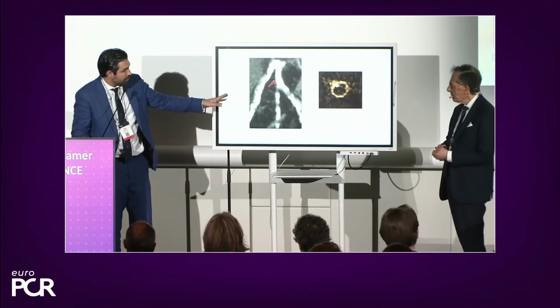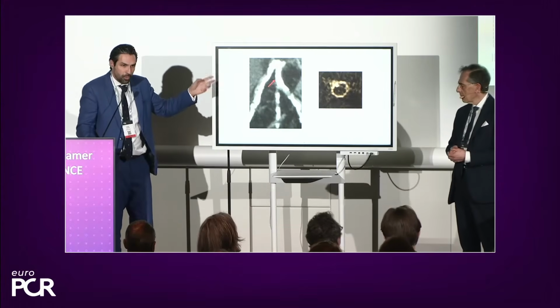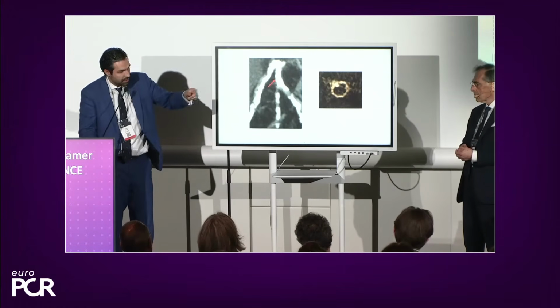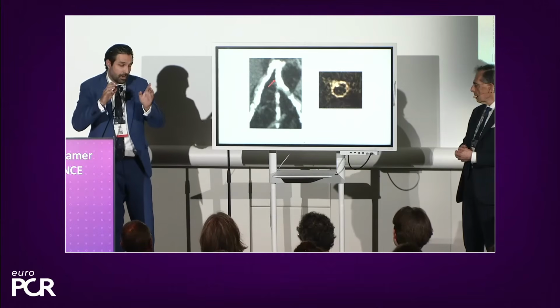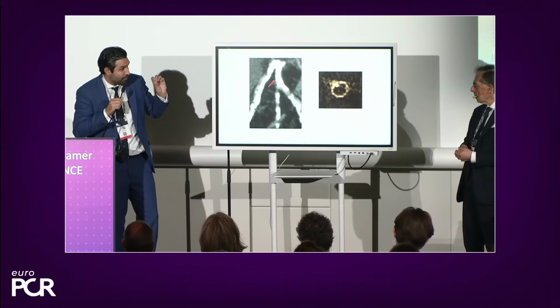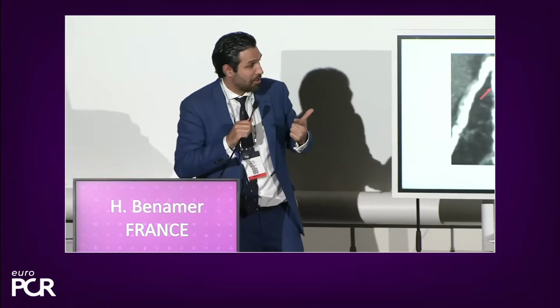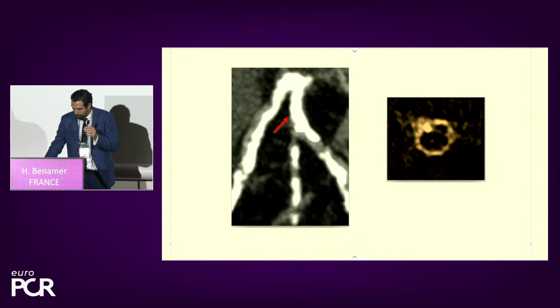And what you're showing here is a CT angiography where calcium is an issue. In CT, you get these blooming artifacts, and sometimes you get false positive stenosis because you cannot see the lumen. With this technology, and you have seen in the case shown by Hakeem, you can really assess the calcium. And what I'm looking forward to start doing, Giulio, is assessing the arc of calcium using this method. So to answer your question, no problem in terms of blooming, and a super important potential application for detection of circumferential calcifications. Okay, let's move on.